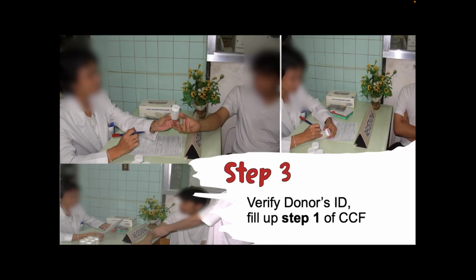And next one, verify the donor's identity. At this time, the specimen container is opened in full view of the donor, and the container must be labeled legibly and completely. Also at this time, step 1 of the CCF is completed by the collector.